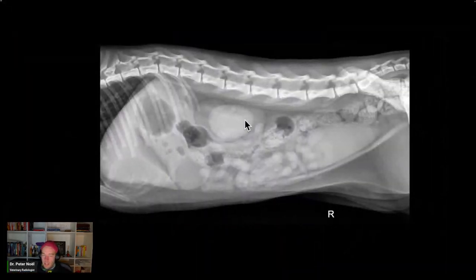The kidneys, in young cats. This is the cranial pole. The cat doesn't have three kidneys. These are superimposed. Here's one kidney, the right, and here's the left kidney, and the so-called third kidney is where they're superimposed. Now, I think these kidneys are normal. Cats that are young have nice, robust, healthy, hydrated kidneys. Intact cats have nice, chunky kidneys. So I think these kidneys are normal.